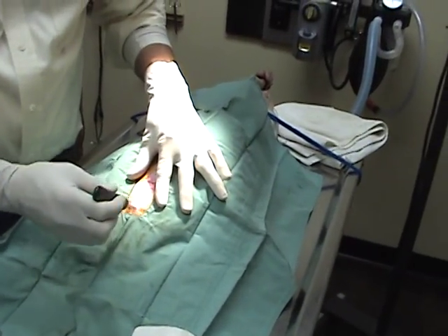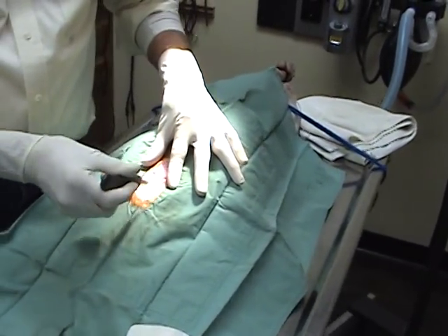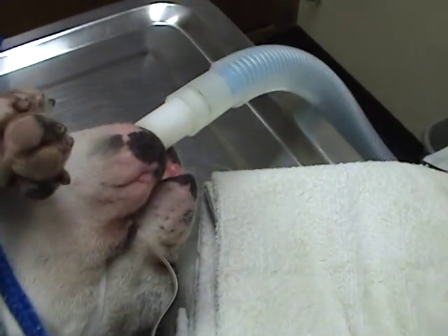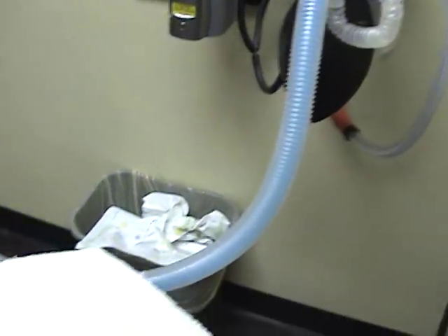So here we are again. It's been about 10 minutes and Genevieve is now completely under. She's intubated and we're making first cuts. You can see that she's got a tube that runs to a machine. Let's make sure that she's kept under.